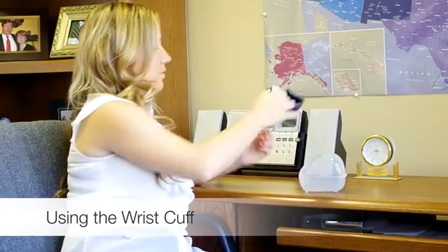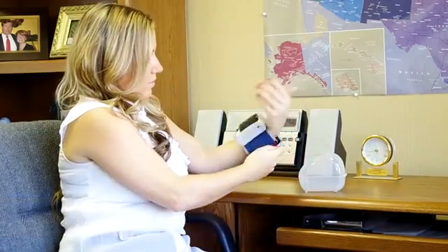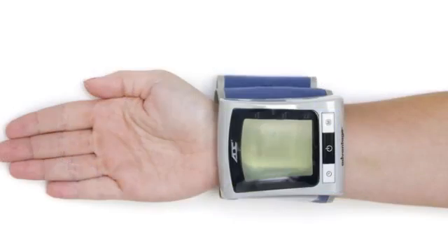If you're using one of ADC's wrist models, remove any jewelry or clothing that may interfere with the reading before putting on the cuff. Hold your hand palm up and slide the monitor onto your wrist with the buttons facing toward you. There should be about a half inch between your hand and the monitor. The cuff should be secure but not feel tight.